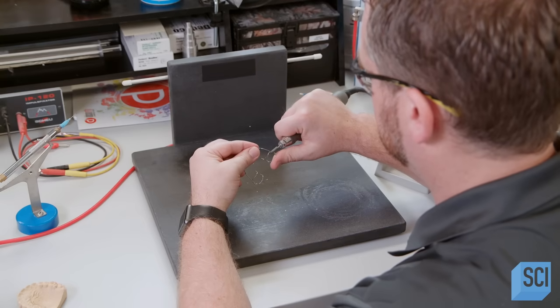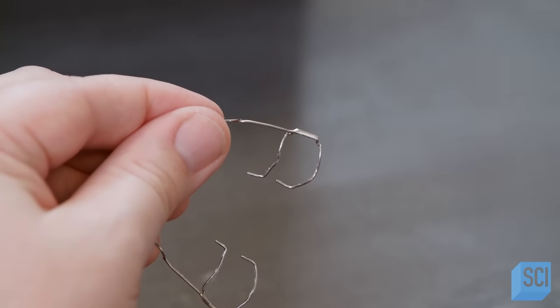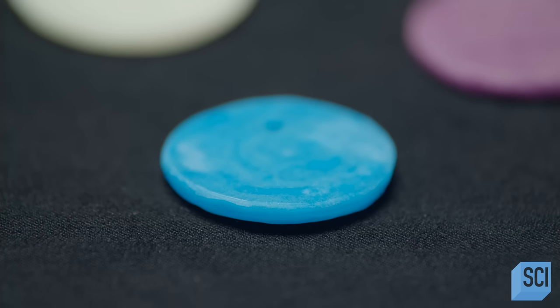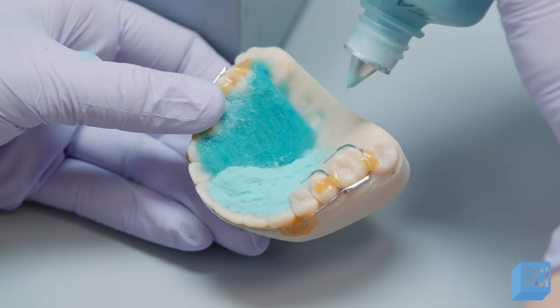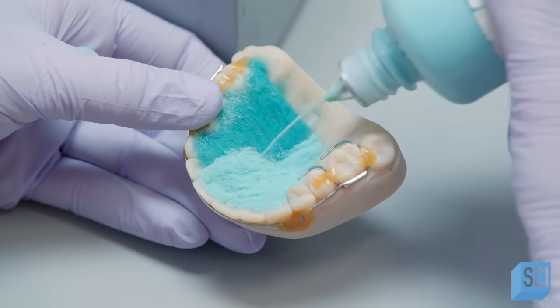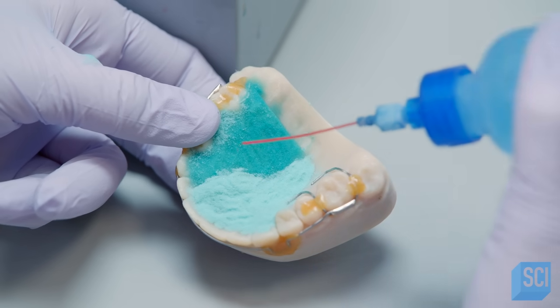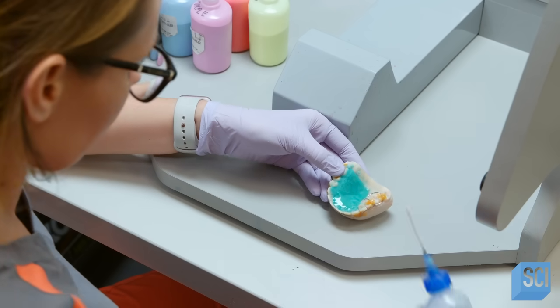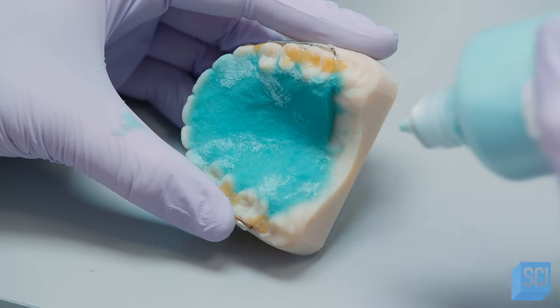He steams off the wax, removes the finished retainer wire from the model, and polishes the solder joint. The retainer's pallet is made of acrylic and comes in multiple colors. A technician waxes the wire onto the model, then applies the acrylic to the pallet, embedding the ends of the wire. The acrylic is made up of liquid and powder, which react when mixed. She applies about three layers of each to the pallet, producing an eighth-inch thick mold.